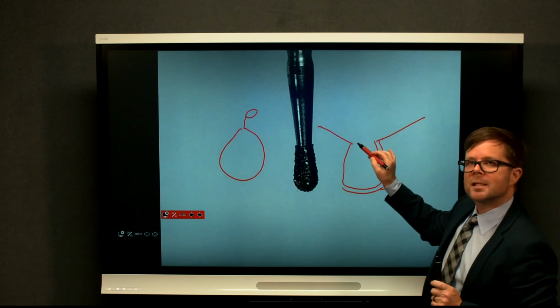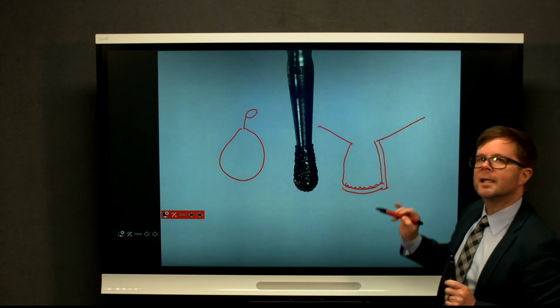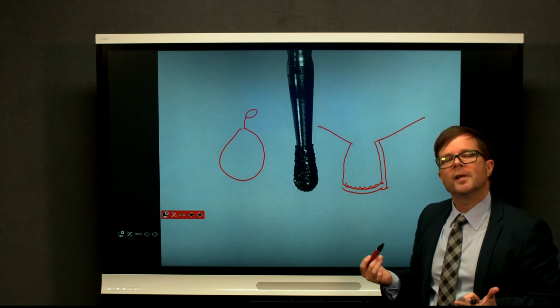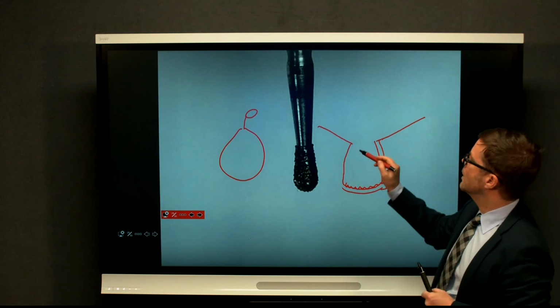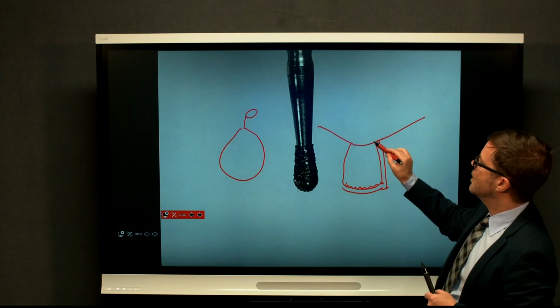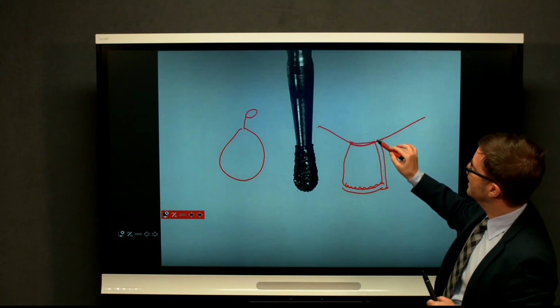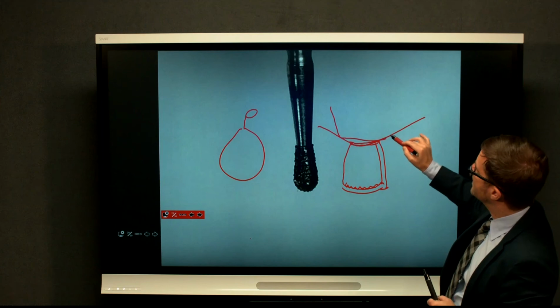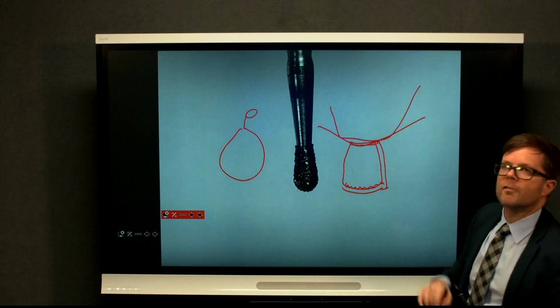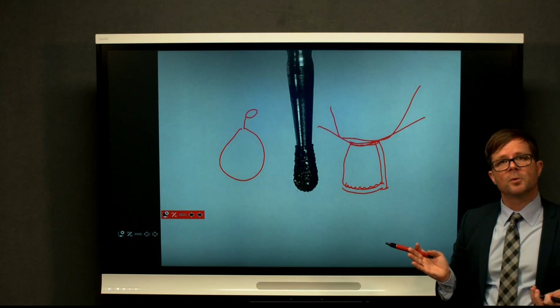Your access allows you to eliminate necrotic dentine, and you have convenience form, you're able to get your instruments into place. It also allows you to place an adhesive restoration because the surface area here is relatively small, so the occlusion from the tooth above it is going to have minimal impact on the restoration. This is your ideal for minimal cavities.